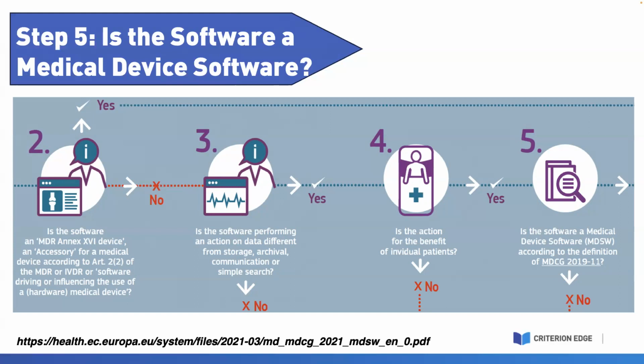Medical device software is software that's intended to be used alone or in combination for the same intended purpose as a medical device. Software must have a medical purpose on its own to be qualified as medical device software. It's important to pay attention to that intended purpose, because the intended purpose as described by the manufacturer of the software is going to be highly relevant for the qualification and the classification for any of these devices.